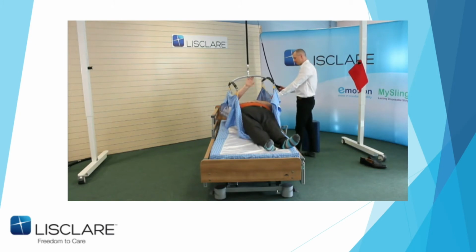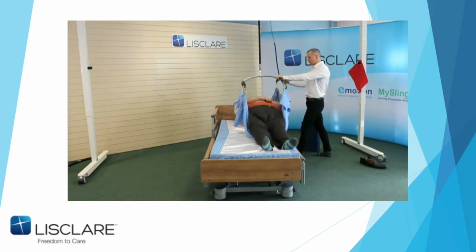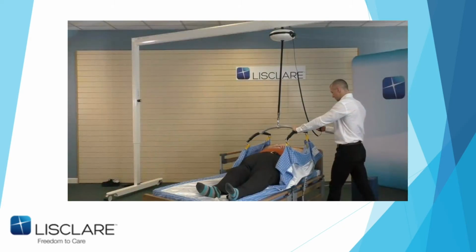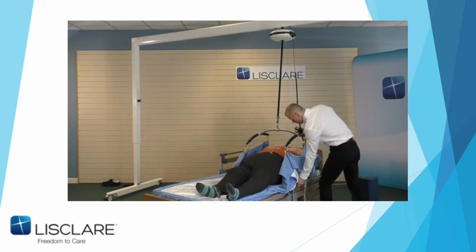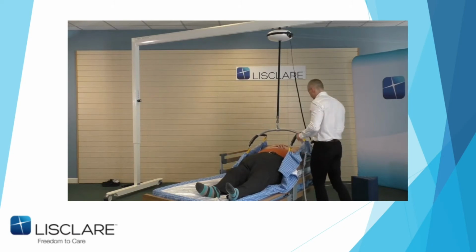That's enough, John. You should be able to just grab the spreader bar, lean in back, and slide me towards the edge of the bed. There you go. Okay. Done. And he lowers it down. At this point, he knows I'm close to the side of the bed, so he'll lift that side rail up. Could have got a wee bit further there, John, but we can show that again if they want.